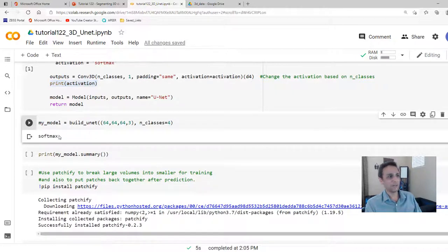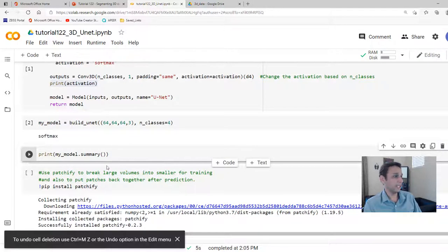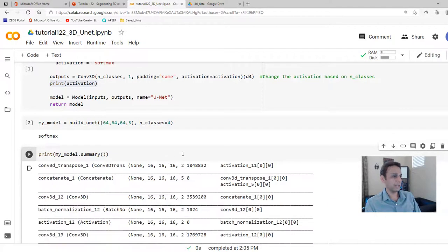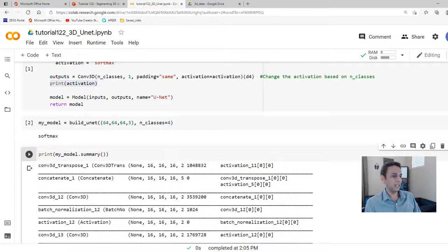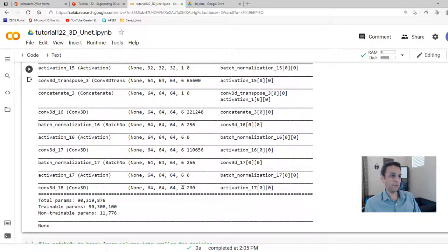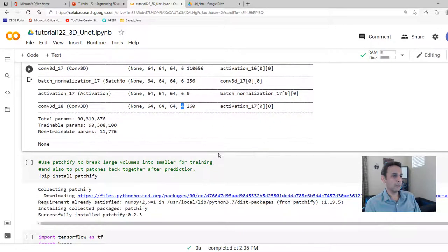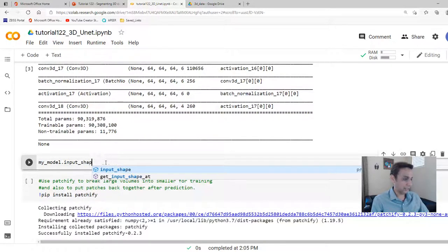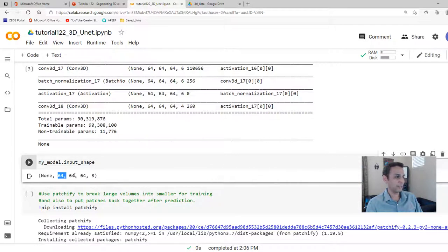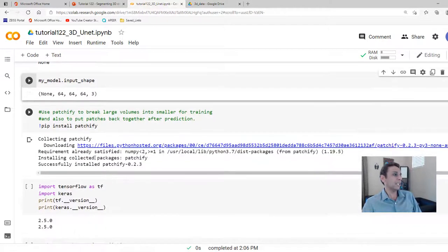The model uses softmax activation for multi-class classification. In the summary you can see 64×64×64 all the way through, ending with 64×64×64×4 — four classes. To check input and output shape, use `my_model.input_shape`, which should give you 64×64×64×3. Now let's install patchify — a library for chopping large images into smaller ones, working for both 2D and 3D. The TensorFlow and Keras version I'm using is 2.5.